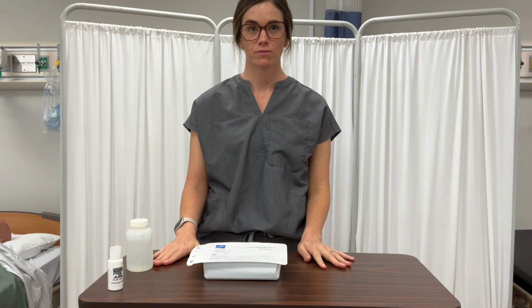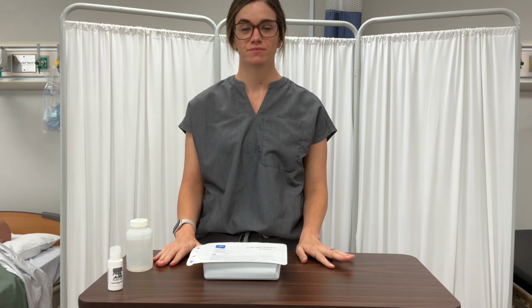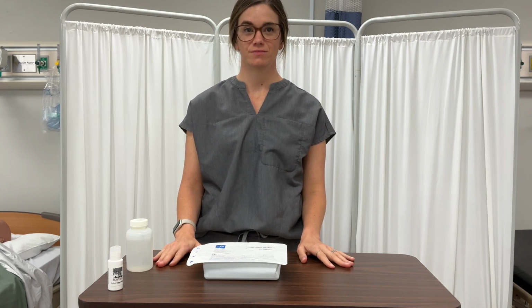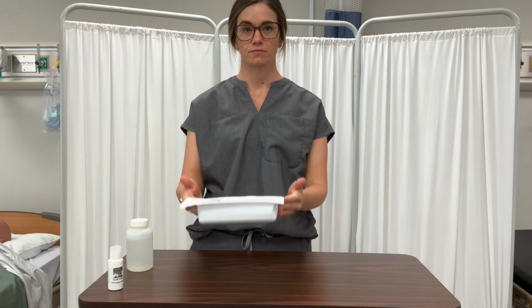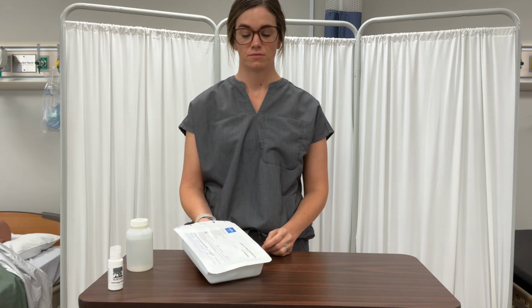Okay, guys, so now we're going to pour sterile solutions into a sterile field. And you can see Miss Ratcliffe has a package in front of her that is a sterile package, and so she's going to show us how we're going to open this up and get it ready.